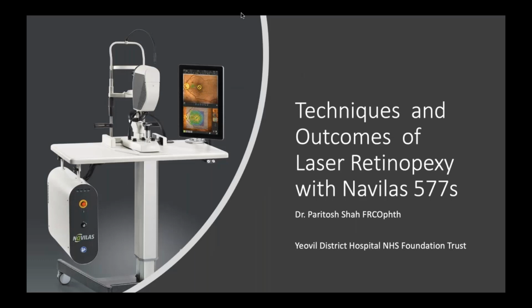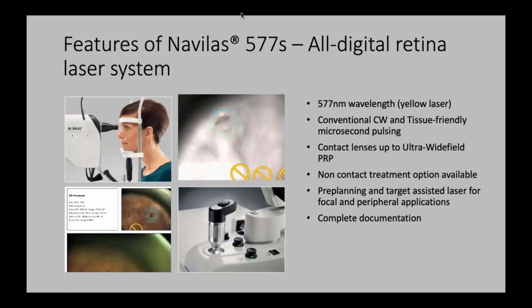Hello and good afternoon. As Phil has just outlined, today's webinar is about techniques and outcomes of laser retinopexy using the Navilas 577S, which is a navigated laser system with a built-in fundus camera. It delivers a 577 nanometer wavelength yellow laser capable of conventional continuous wave and microsecond pulsing.